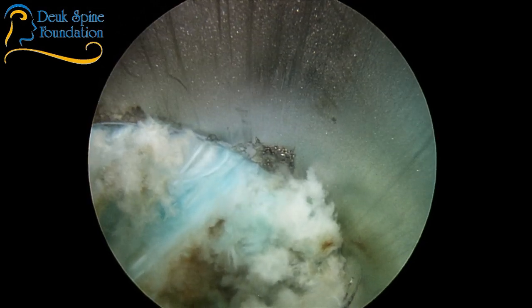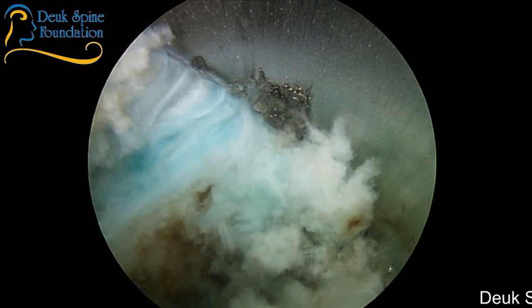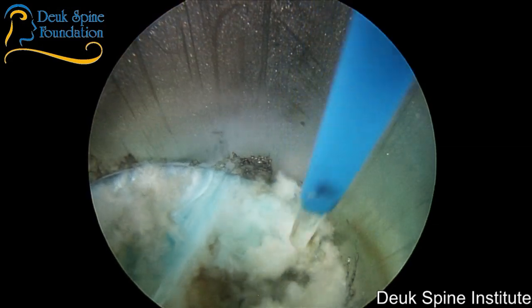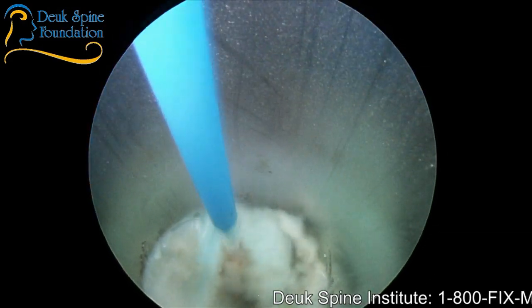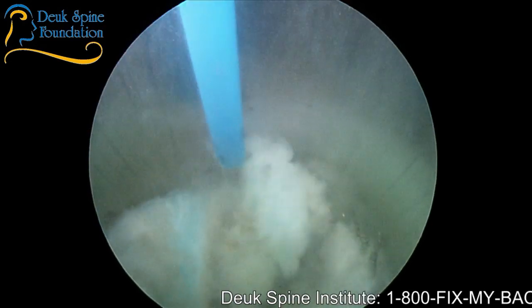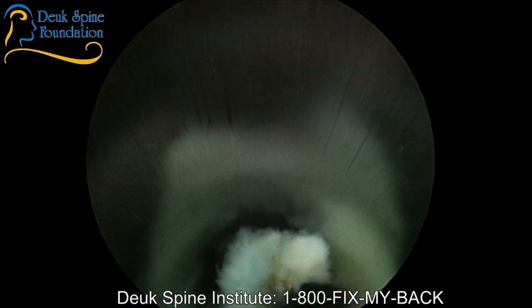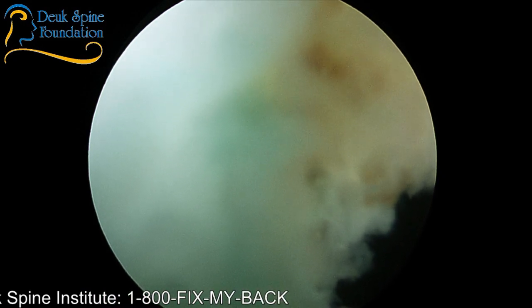We have another question. We have a viewer who says, I've been in pain 1.5 years, nerve pain down my leg and hip. Would the surgery be an option? The answer is yes, it would. Standby laser. Well, that's a big herniation coming out. The answer is yes, for sure, if your pain is from a herniated disc.